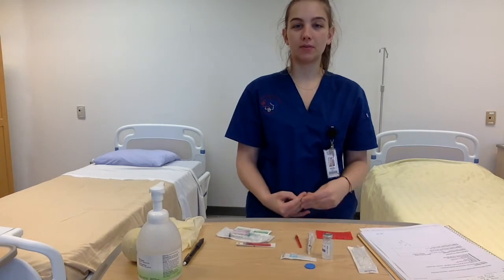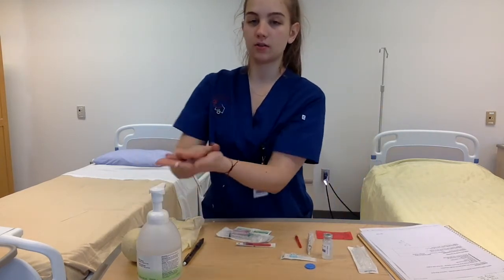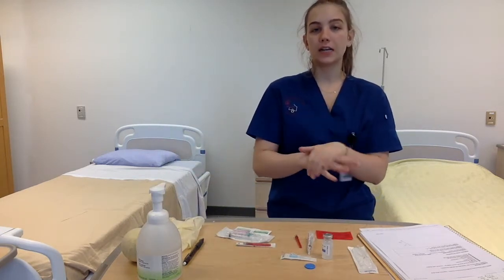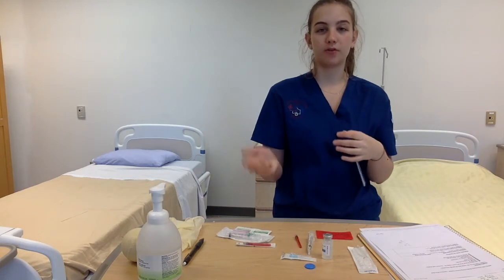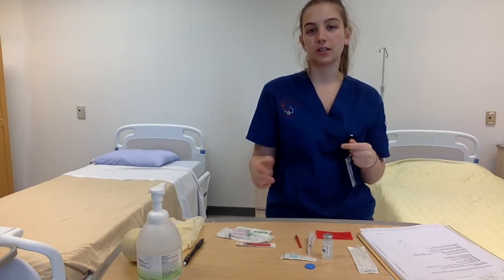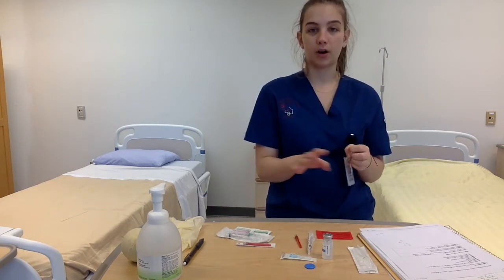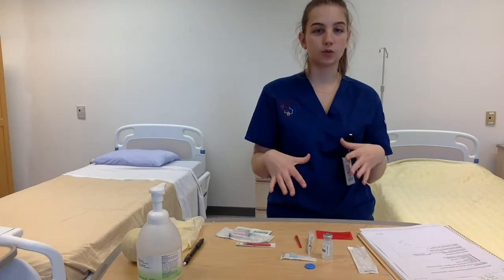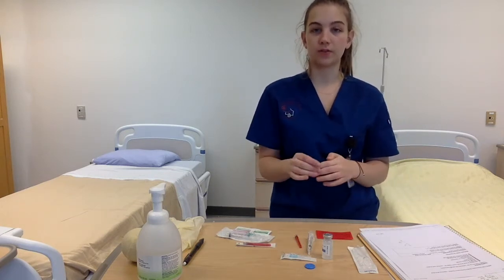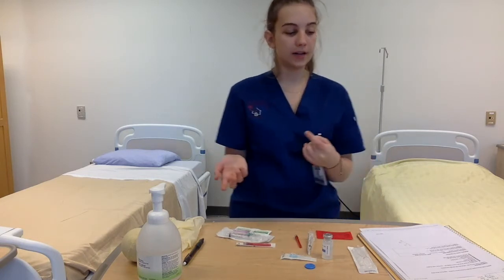Okay, so today we're going to be giving the subcutaneous injection first, so I'm just going to start off by washing my hands before I do anything else. It's important to take into account the size of the patient before you're giving them an injection, because you need to adjust the needle size accordingly. So for this injection, Mario Mancini is just of average weight, so I've chosen to use for his subcutaneous injection a 25 gauge needle, which should be adequate to get the medication where it needs to be.